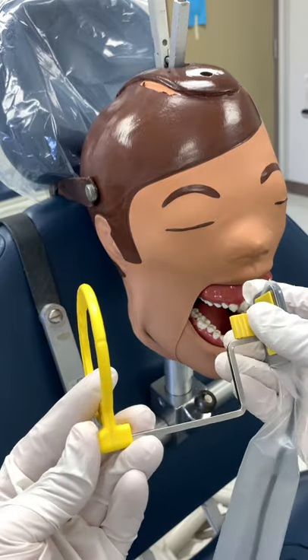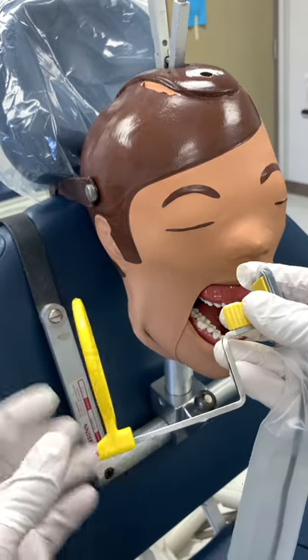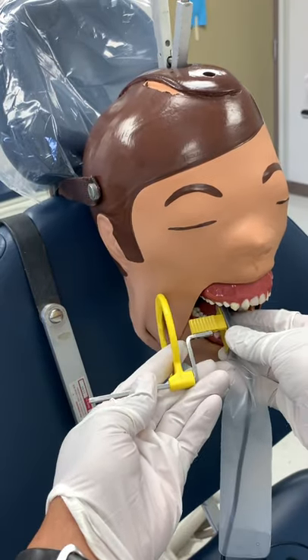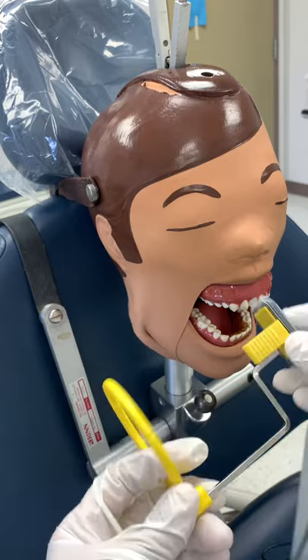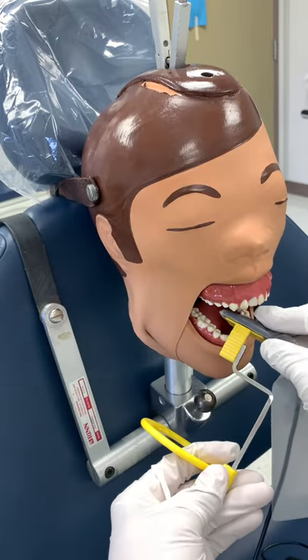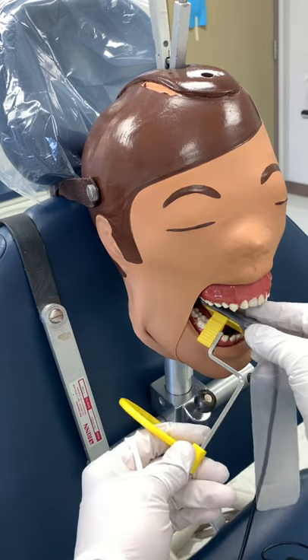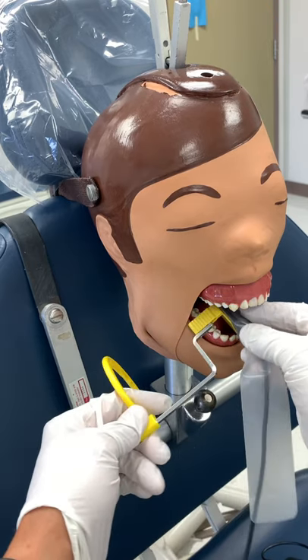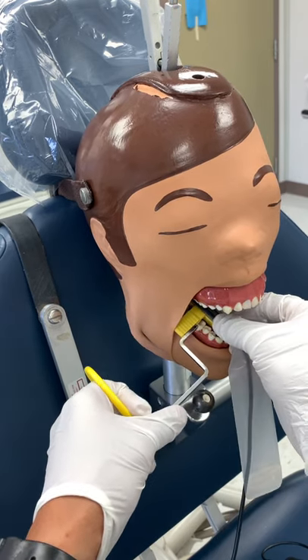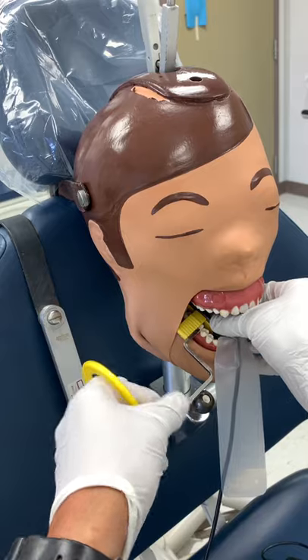What I'll do is make sure that the ring is all the way out, because if I try to put it in this way, it really hits the patient. So I'll have it all the way out, and then I'm going to take it at an angle. I'll have the patient wide open — not as wide as possible, but wide — and then try to bring the cheek out. It's obviously easier with dex. Then angle it down and bring it down like that.